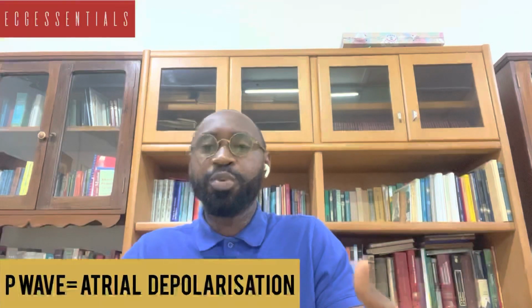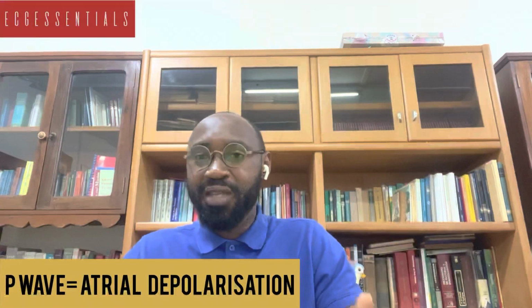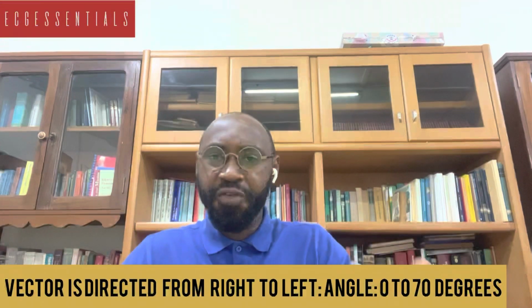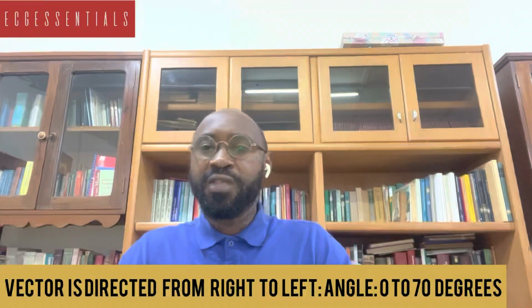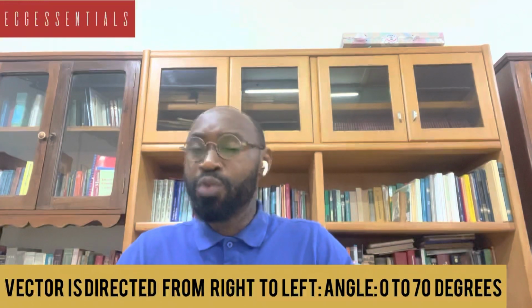So for the P wave, which we have said represents atrial depolarization, the vector of current flow points from the right to the left and slightly inferiorly. Remember, we have said that everything starts from the sinus node.